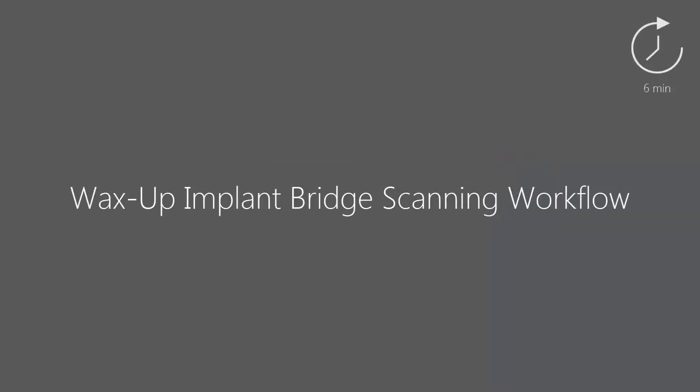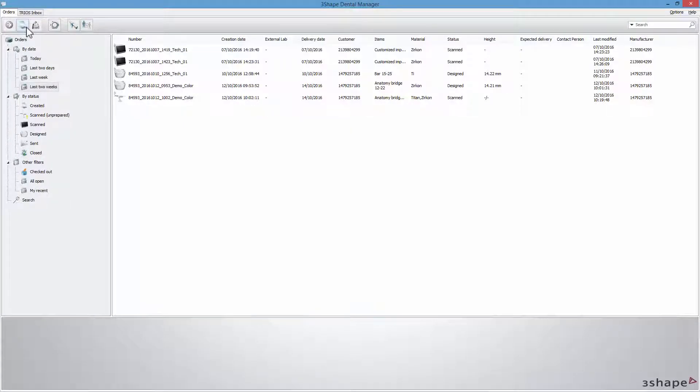In this video we will show you the scanning workflow for a wax-up implant bridge. Start from creating an order.